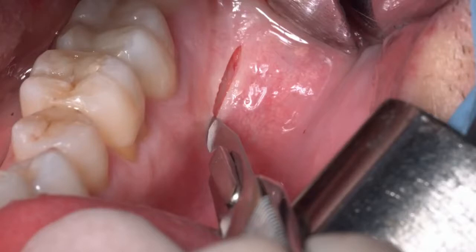Just below the mucogingival junction, you only have to leave coronally two or three millimeters of alveolar mucosa to be able to suture the flap at the end of the procedure, without damaging the periosteum of the adjacent teeth.